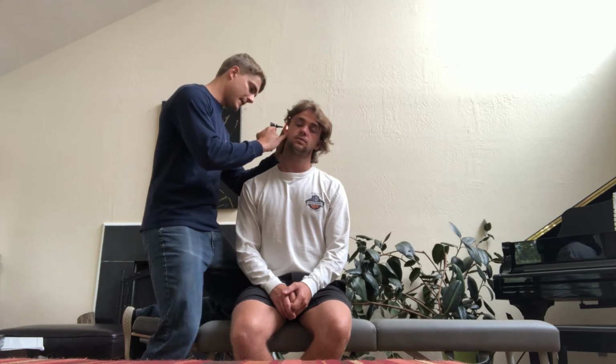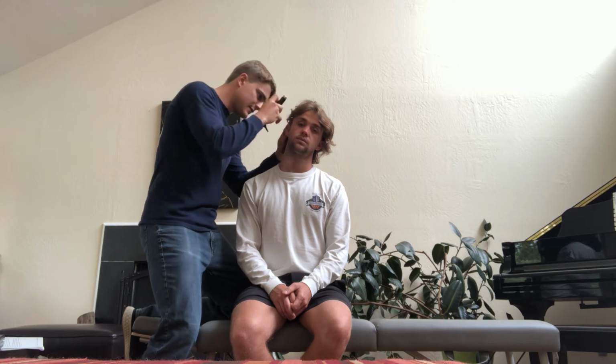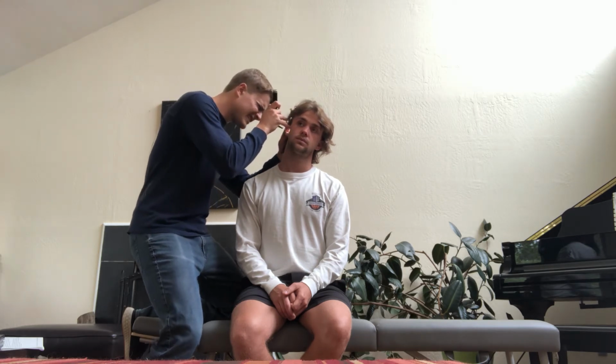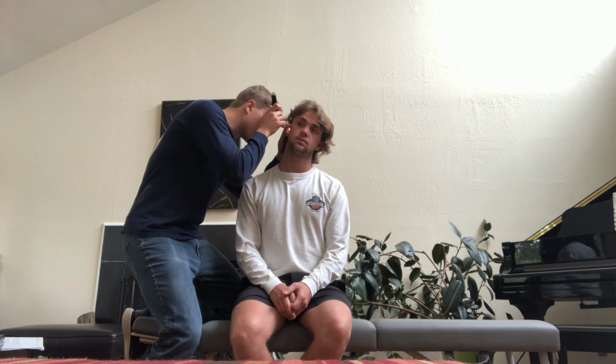Okay. So the next part of the exam, we're actually going to be looking in the ear. So I'm going to tilt the patient's head back. I'm going to use my right hand, right eye, going in the right ear of the patient, and pinky on the patient's cheek to prevent any slipping.